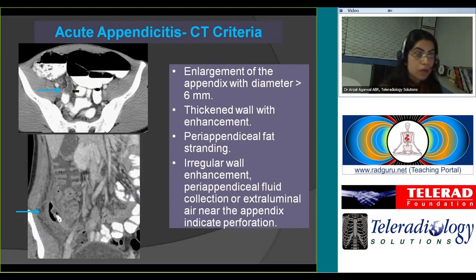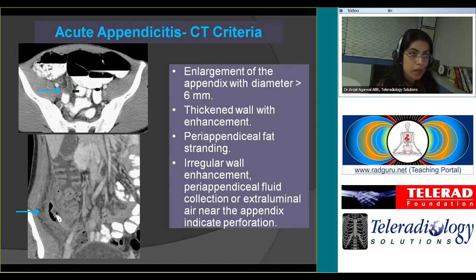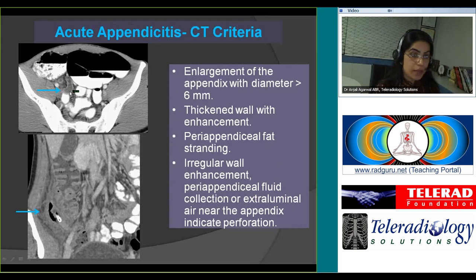Looking at case examples of acute appendicitis: this image demonstrates a fluid-filled thickened appendix. Based on CT criteria, if you see a fluid-filled appendix with a diameter greater than 6 millimeters, you can suggest the diagnosis of appendicitis. Notice there is good contrast opacification of the cecum, but the appendix is non-opacified, indicating increased intraluminal pressure and perhaps obstruction at the proximal aspect.